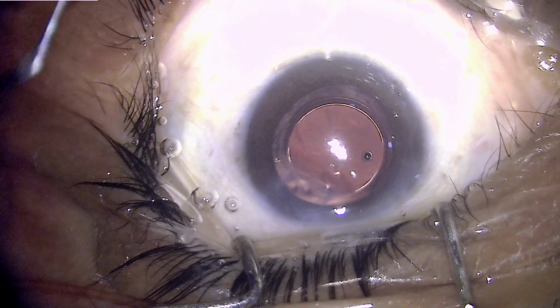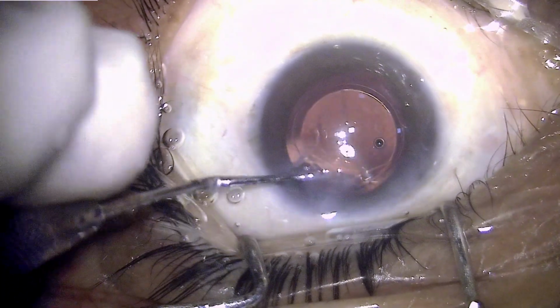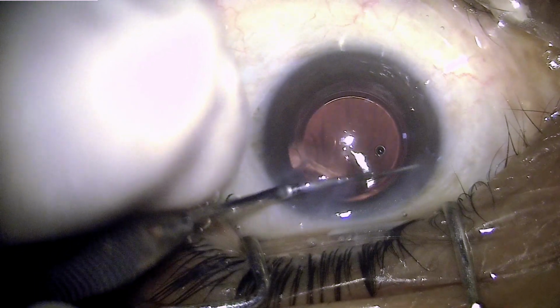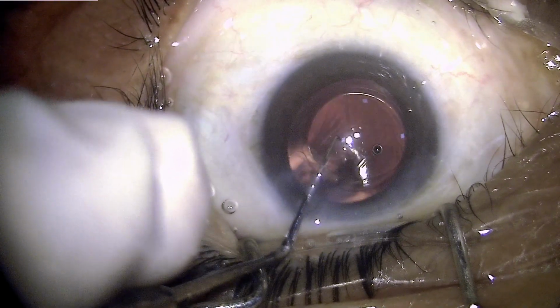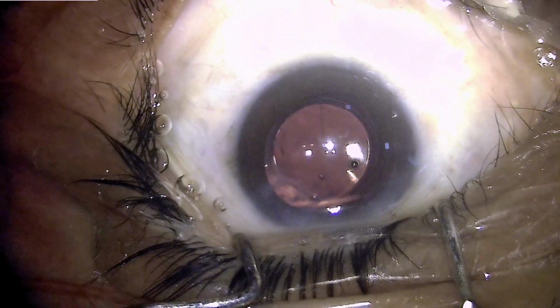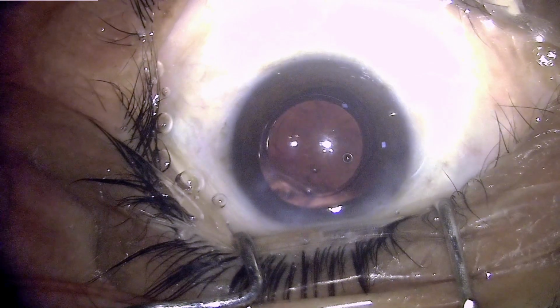Removing the viscoelastic gel is an important job because one should be very conscious that if the viscoelastic gel is left behind, it will definitely cause a post-op intraocular pressure rise. This was sweeping the fornices in the anterior chamber so as to remove any strand of vitreous which you couldn't find.